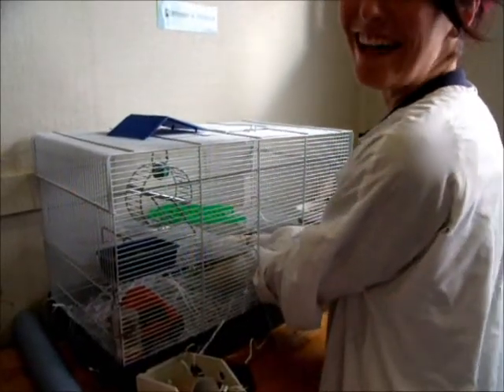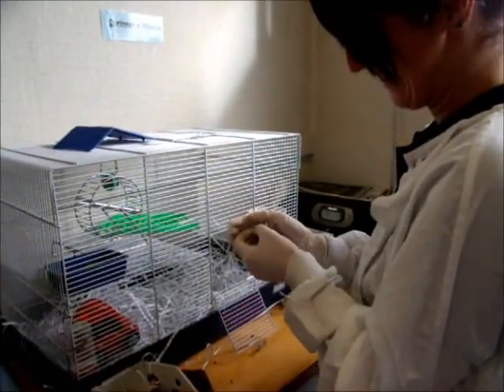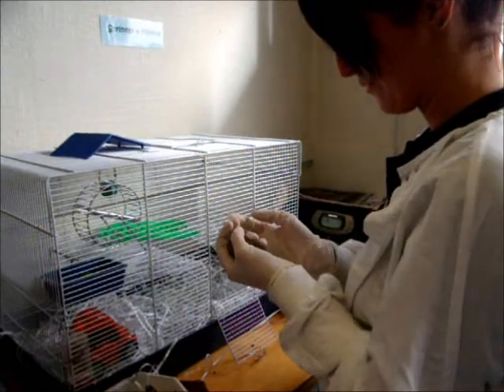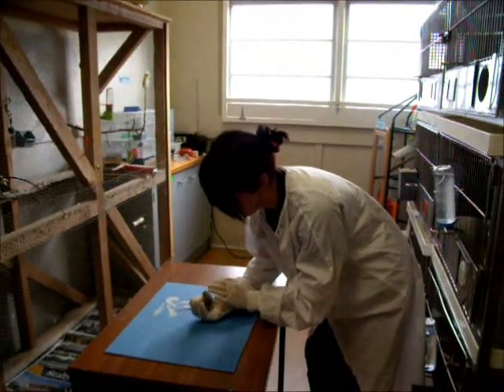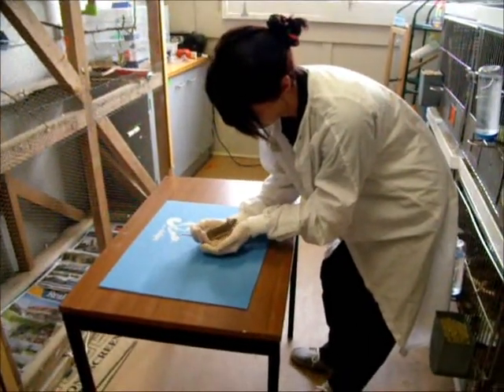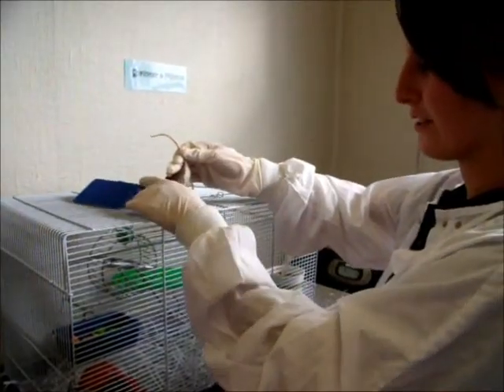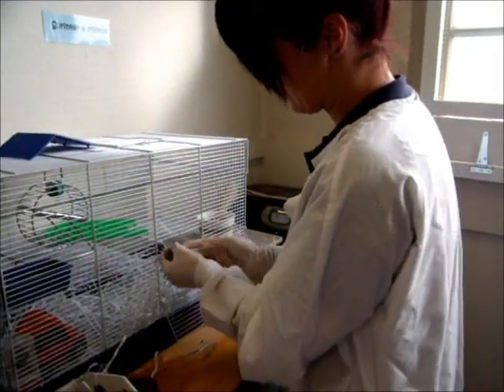This is how I would catch a mouse and remove it from its cage. Hold a mouse for a general body examination. Hold a mouse to get sex.